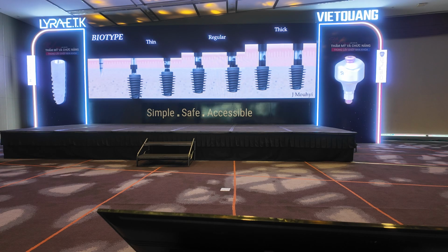And imagine that when we are doing the guide, setting the guide, we will take in our brain all those parameters to give you the possibility to place the implant depending on the height of the soft tissue and depending on the quality of the bone.